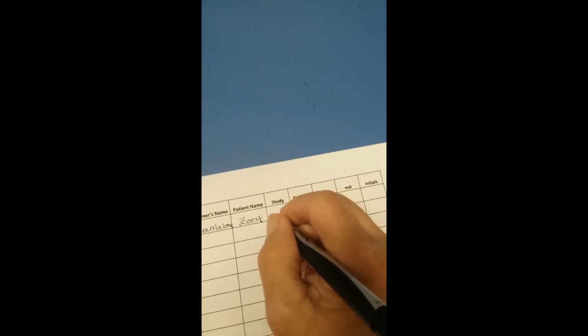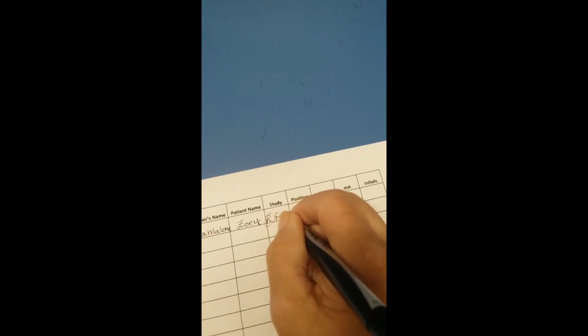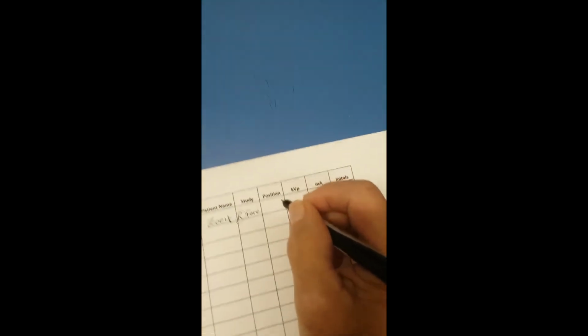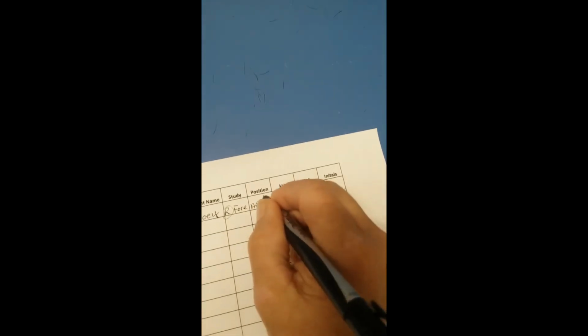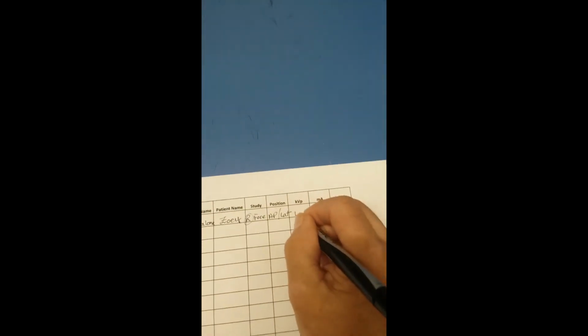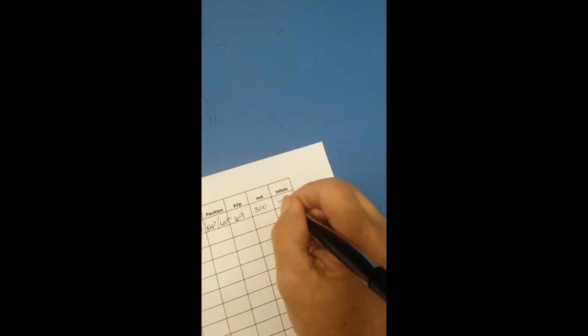Let's just say we did a right foreleg. The position that we had them in. And the settings from our machine. Our kVp was 69, and our milliamps was 300, and the initials of the person filling it out, which is me.